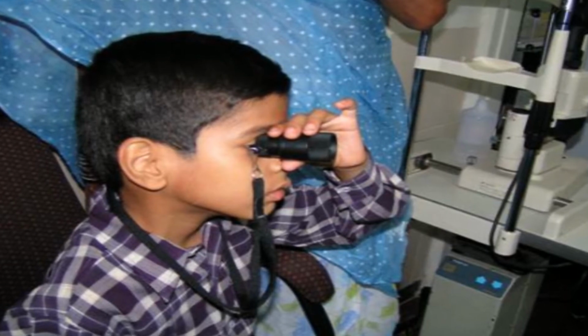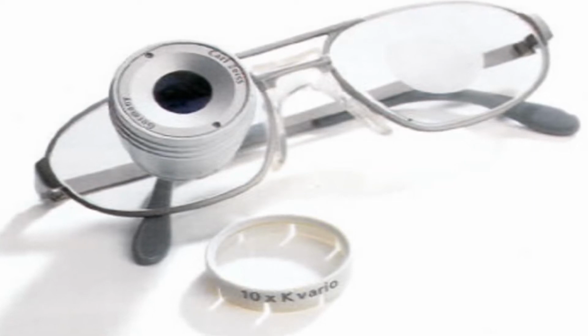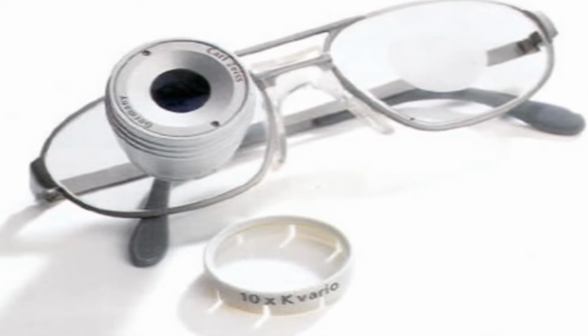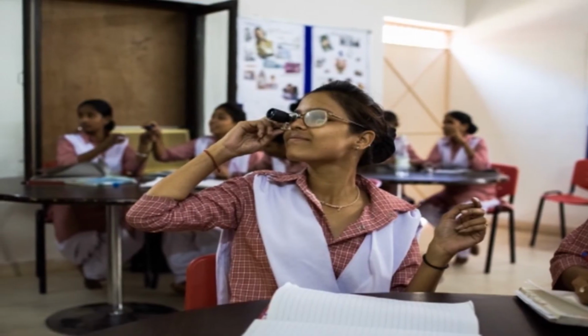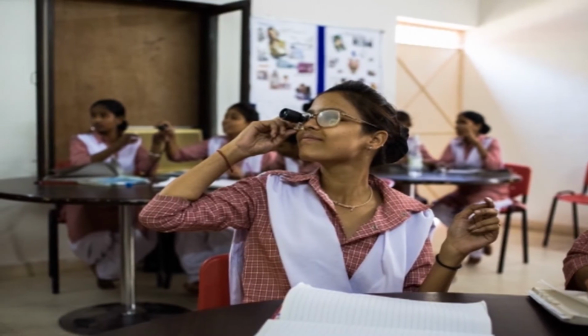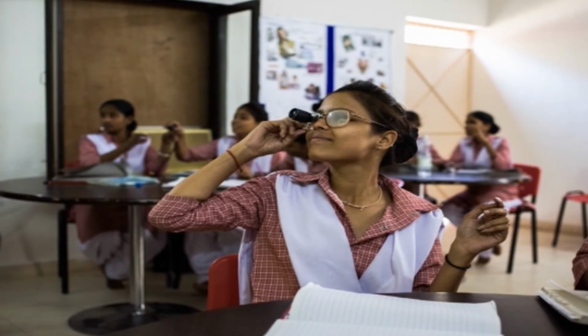Spectacle mounted telescope is mounted on a spectacle frame and can be used for longer periods of time. However, the field of view is smaller compared to other models. It is useful for children with low vision for doing blackboard work. The telescopic eye can be used for reading the blackboard letters and the other eye can be used for writing.